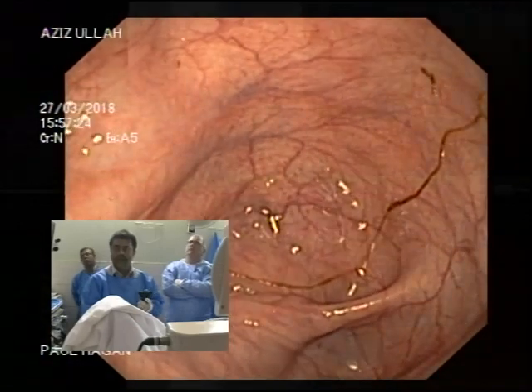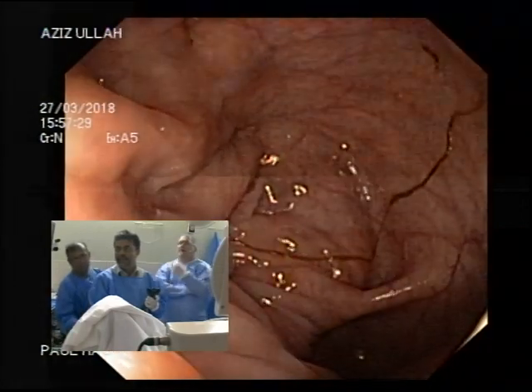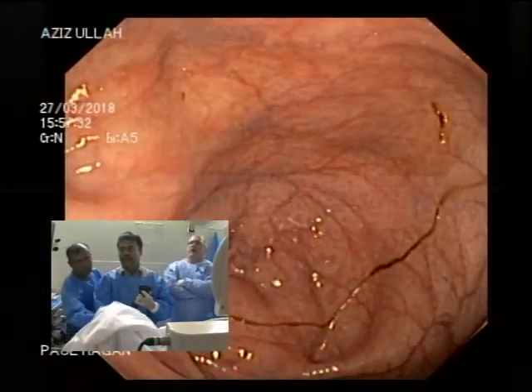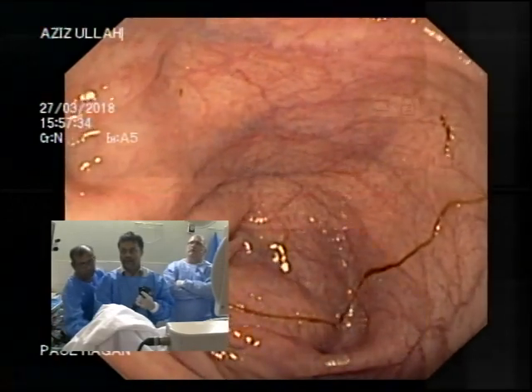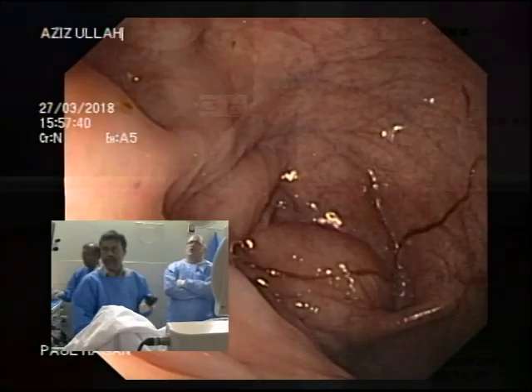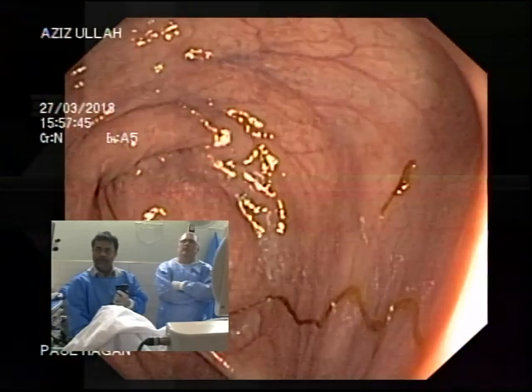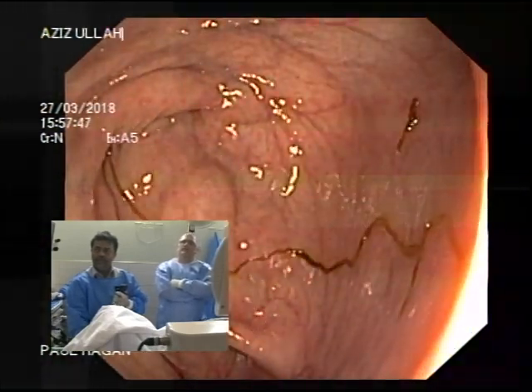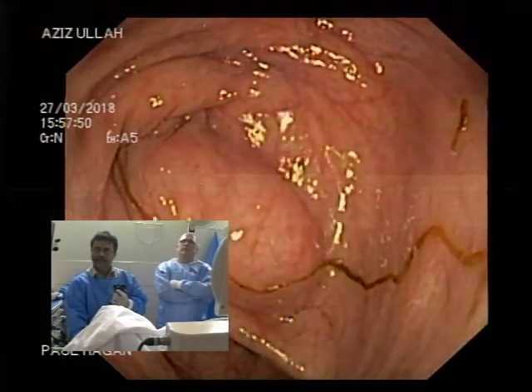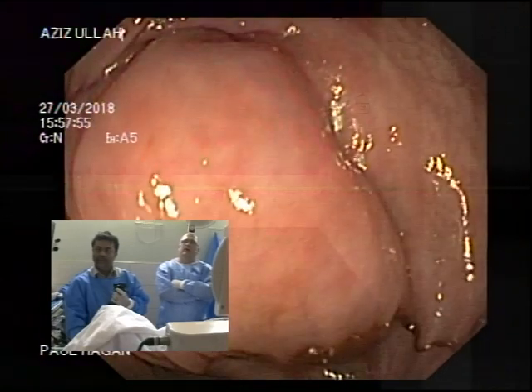Take some of the air down. That's enough. Your tip has to be a lot higher. Now take the scope back, withdraw. Slowly withdraw. Slowly tip up. Slowly. Keep coming back. Now, anti-clockwise torque to turn the scope down the lumen.